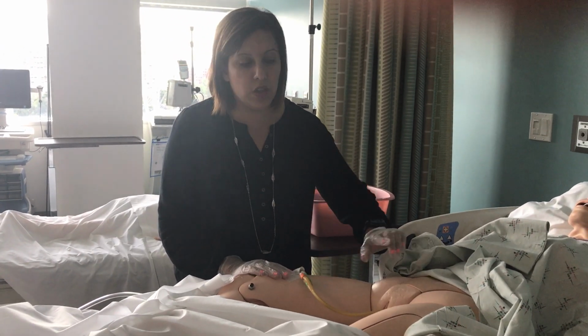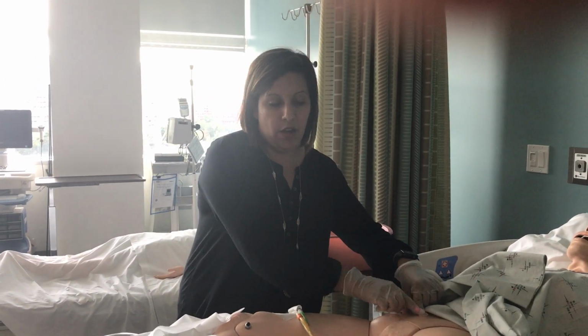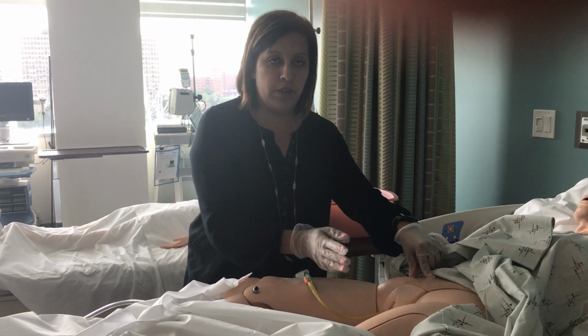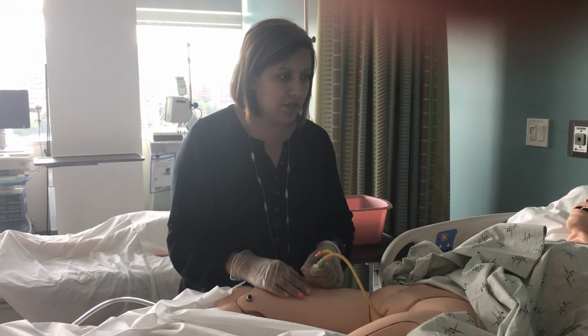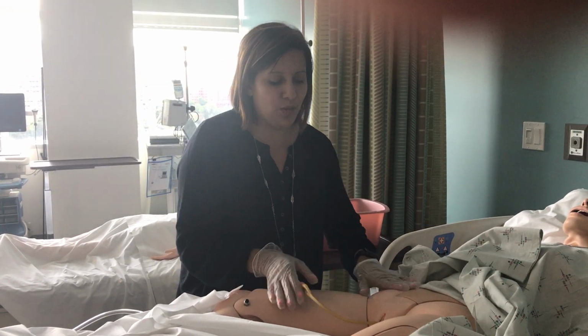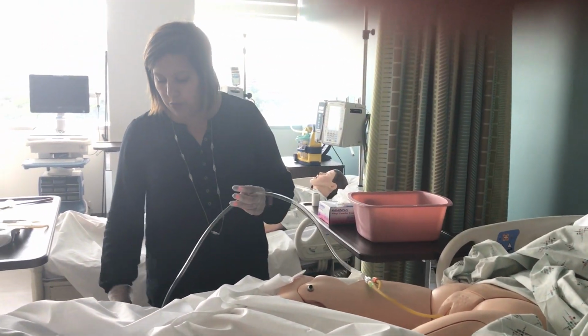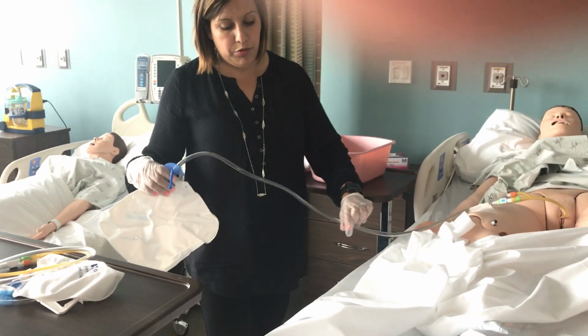For male patients, they usually will have them taped on their belly, because sometimes the penis will go upwards when they urinate, so it's about the way they have it set up. With your catheter bag, it should be free flowing.